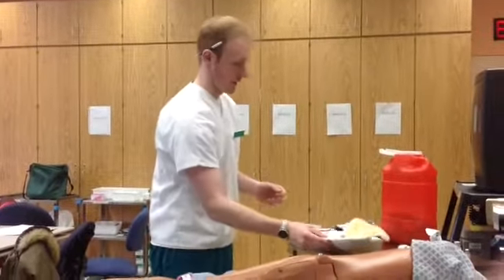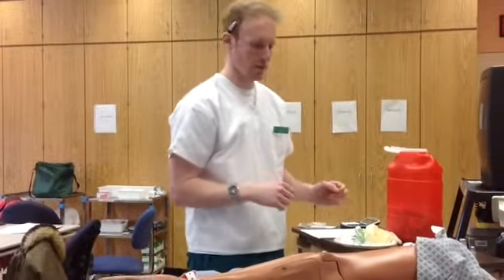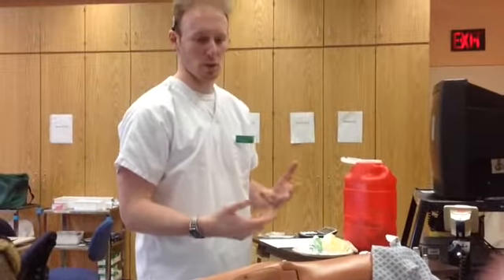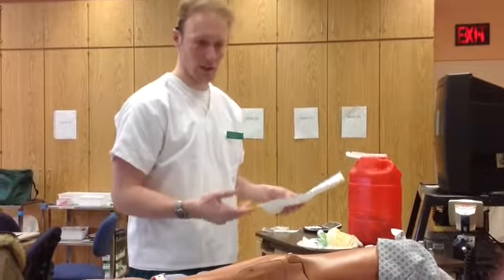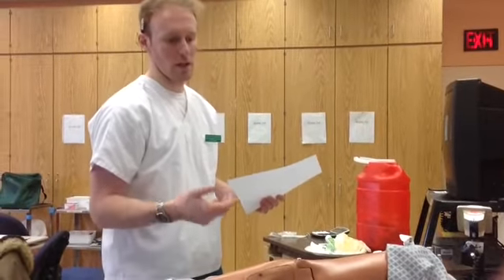So I'll take my plate, come to my patient's room, knock knock, shut the door for privacy. Hi Charles, my name's Justin, I'm a student nurse from HEC. I'm here today to give you your Bicillin injection. I'm going to be giving it to you intramuscularly in your right leg.